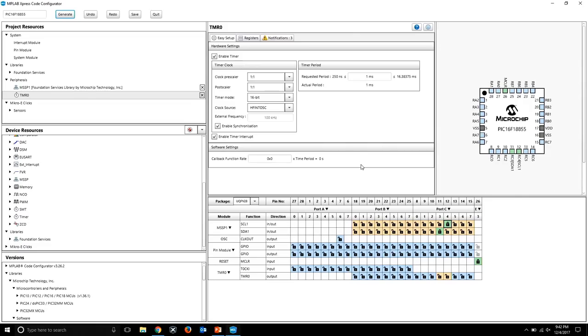So at this point, I am just going to go back to MCC and add the EUSART module that we have been talking about. And where do I find it, Edwin? Under Device Resources, right? Yes, that is correct. That's where we have all the things that we have for a PIC, right?